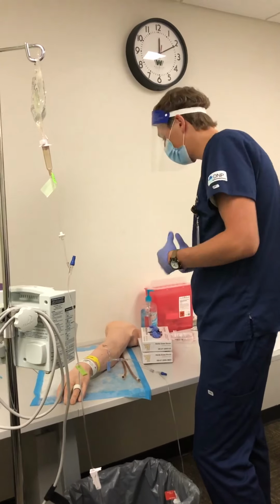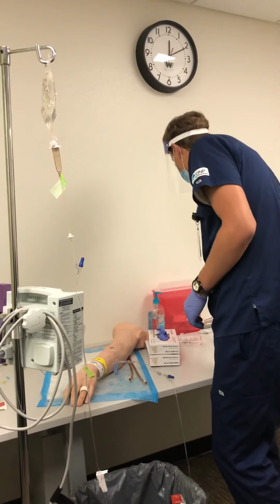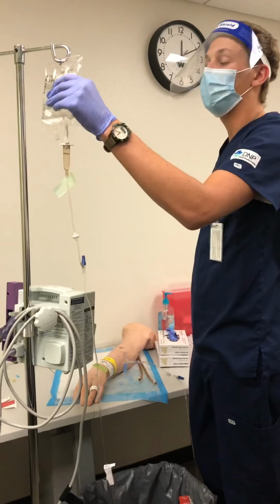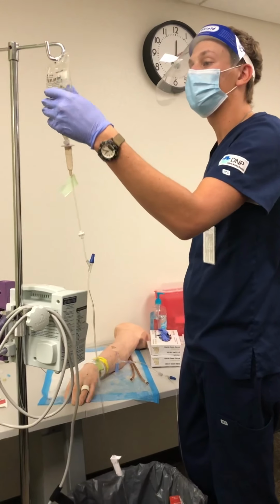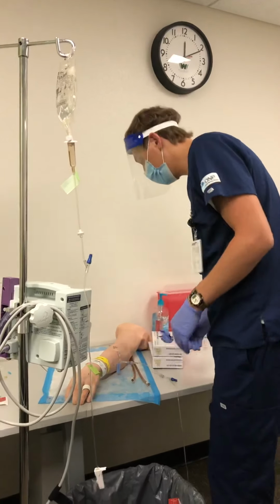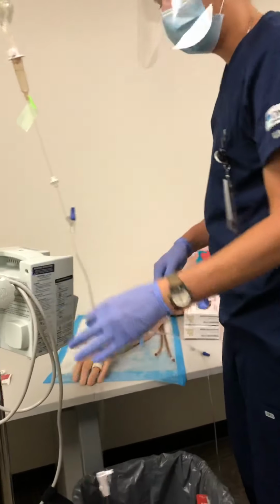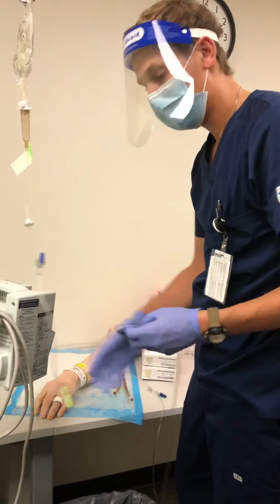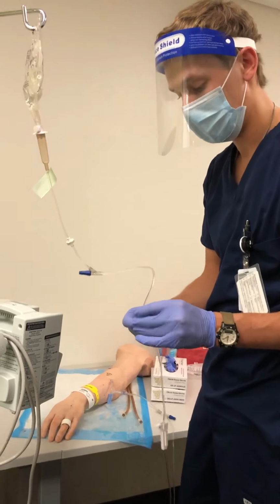Okay, so I'm going to wash, glove up, and then I can go ahead, turn the pump off, make sure that all this has been administered, make sure that we're all good here. Okay, and so I'm going to turn the pump off, lock everything, lock all my locks.